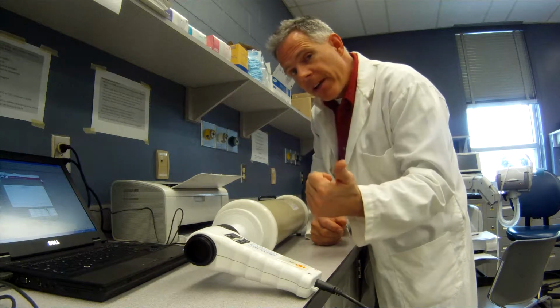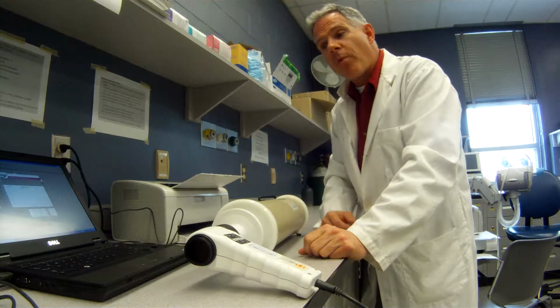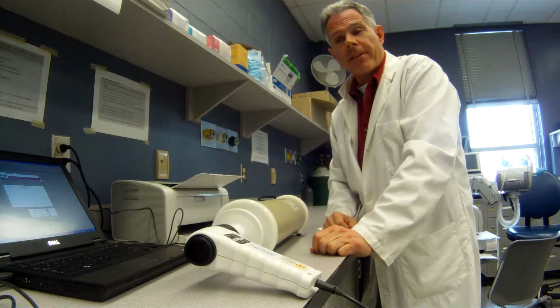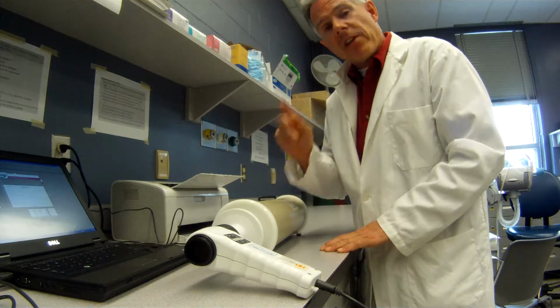We've calibrated it, and we verified the flow at low, medium, and high flow rates. So we can print off our calibration report, sign that as being completed and verified, and put it into our binder. All right? So that's a little bit of an introduction on how to use the HDpft 1000.